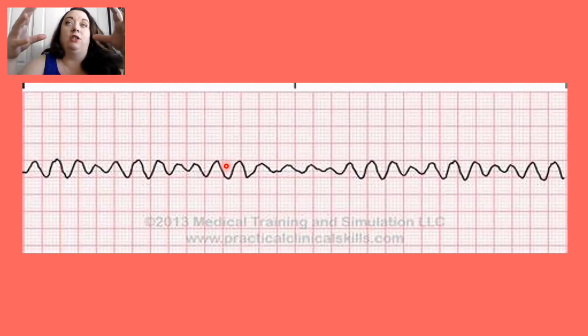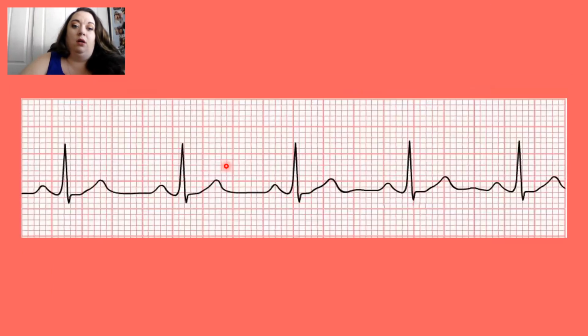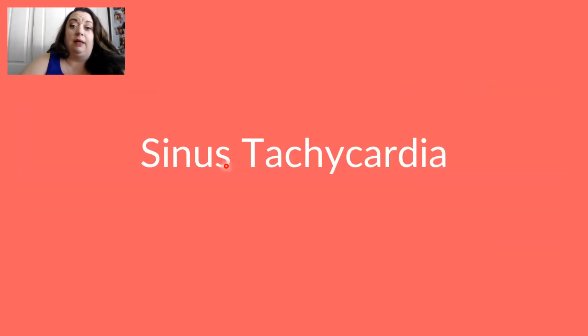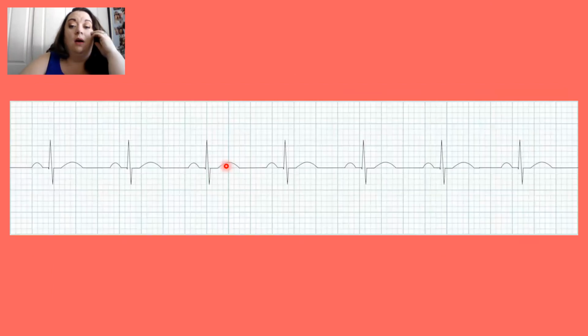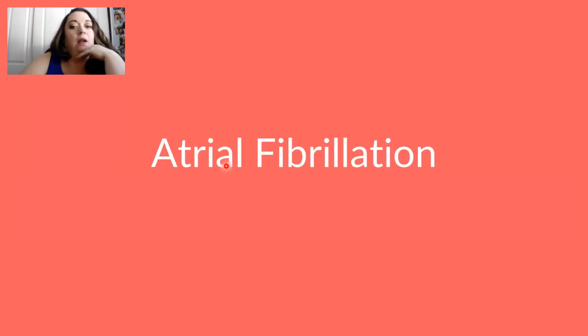So even though on the EKG it looks normal, and let me go back, it'll look pretty normal sometimes, like something like this, something like that. When you have PEA, the electricity is moving to where my waveforms look correct, but if it's not generating a pulse, that means my myocardium is not listening to those signals. So I don't have a pulse, so my patient's still coding. So we cannot shock PEA.